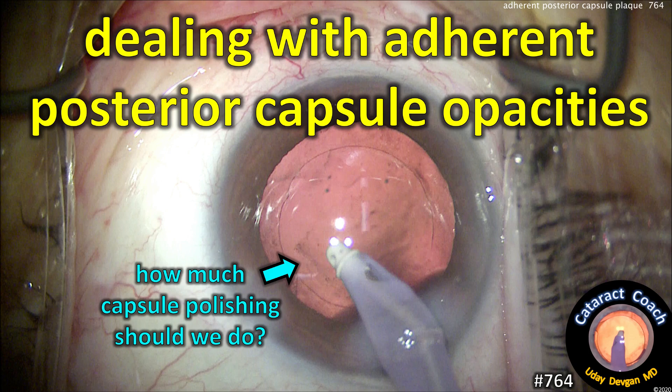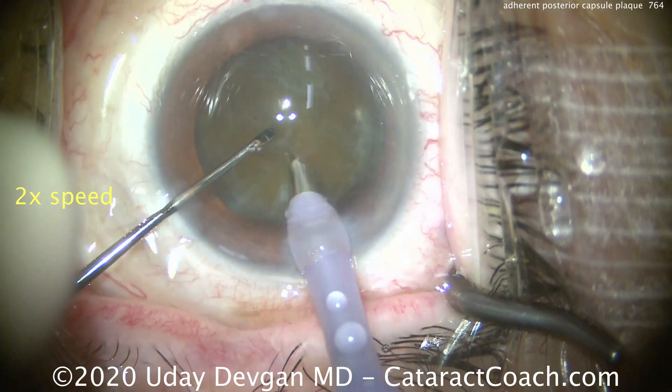CataractCoach.com — dealing with adherent posterior capsule opacities. How much capsule polishing should we do?